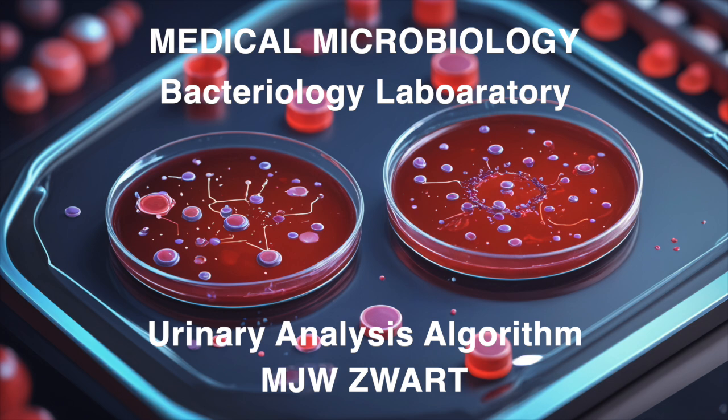Can you tell me a little bit more about how this Q-score actually works? What are we looking for under the microscope? Think of it this way: you're looking for two main cell types. Squamous epithelial cells, which are usually from the skin, and leukocytes, the white blood cell warriors. If you see a high ratio of squamous epithelial cells to leukocytes, it raises a red flag for potential contamination. But if leukocytes are more abundant, it points toward a possible UTI. So it's a quick check to see if the bacteria are invaders from the urinary tract or just harmless hitchhikers from the skin.